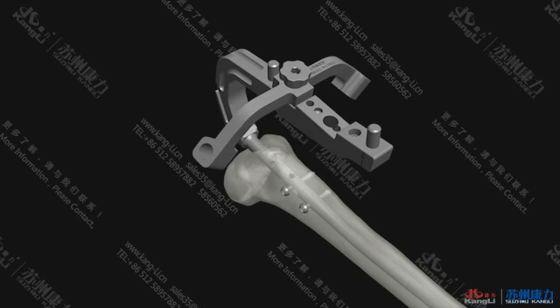Insert the cancellous bone screw sleeve combination into the first oblique locking hole. Keep inserting the cancellous bone screw sleeve combination until it reaches the bone cortex. Remove the drill core and insert the phi 3.2 drill bit.